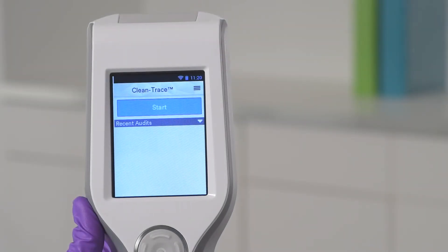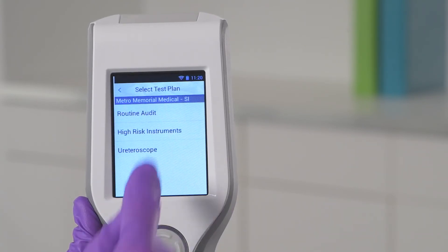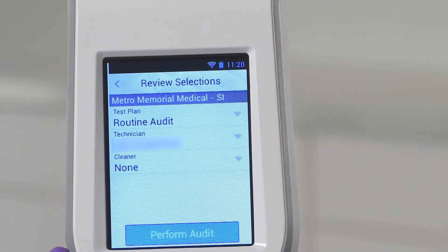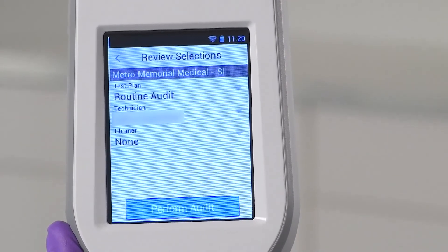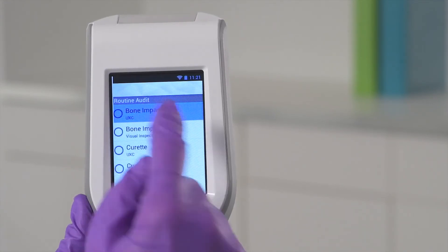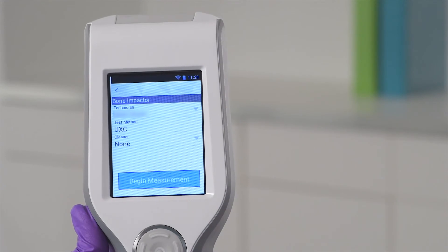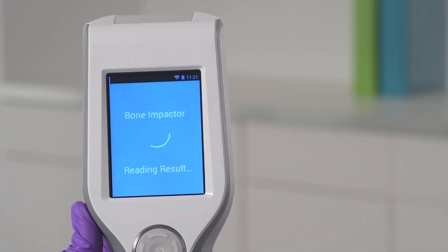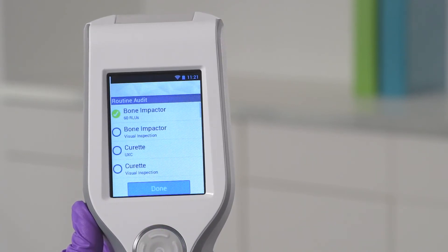If you are using the Clean Trace system to monitor surgical instruments, you will tap Start, then select the test plan. From the Review Selection screen, you can change the test plan, select the technician, or select the value for any user-defined fields that have been set up. When you are satisfied with your selections, tap Perform Audit. Select your instrument, then insert the ATP test into the test chamber and tap Begin Measurement. In 10 seconds or less, you'll see the result — a quantitative RLU value and a pass-fail response for the instrument you were testing. After your result is displayed, tap Return. Repeat this process until all instruments have been tested. Tap Done when complete.